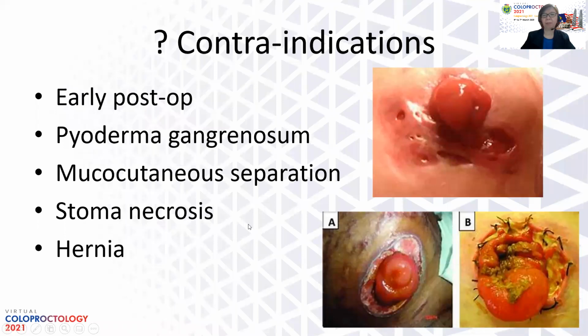And you may be thinking whether a convex wafer can be used for just anyone, or is there any contraindication? In fact, this is a very interesting topic. There is a lot of contradictory literature. Some say yes, some say no. Generally, most literature says that there's no contraindication, but in some cases, we really have to use it with a lot of care, especially in patients early post-op. You do not want to exert more pressure onto the surrounding skin because it's still sore, or maybe sometimes swollen.